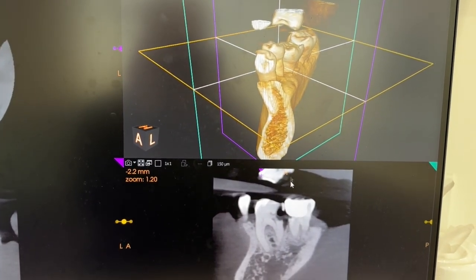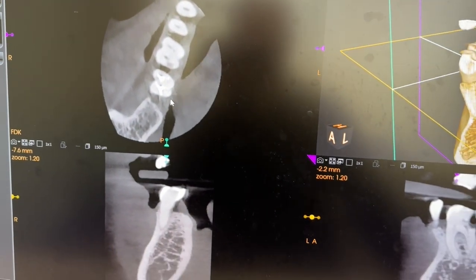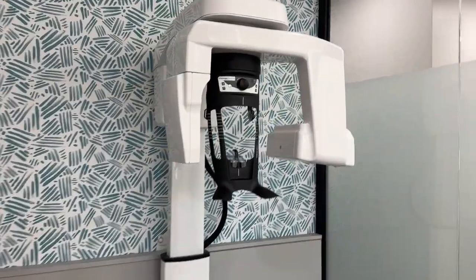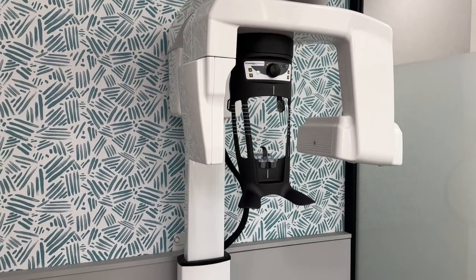Have you ever been to your dental office and they said you needed a cone beam x-ray? What is a cone beam? A cone beam x-ray is a 3D image of your tooth. You'll stand in a machine like this, it spins around your head, and all you have to do is stand super still.